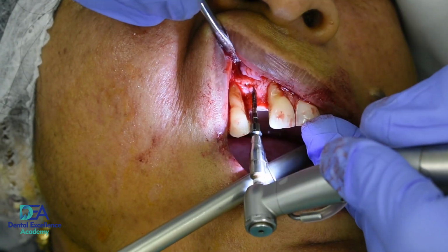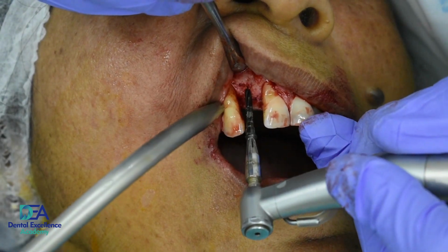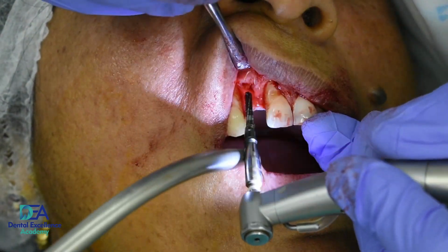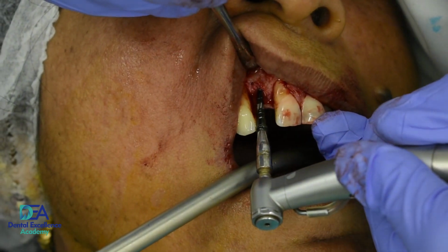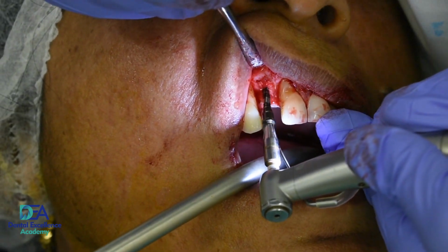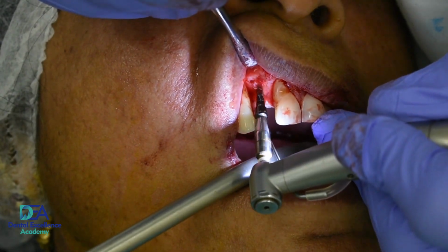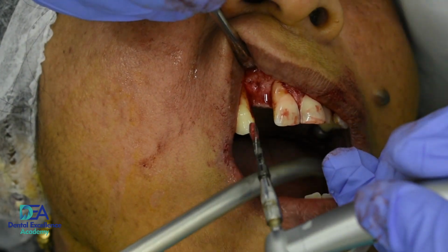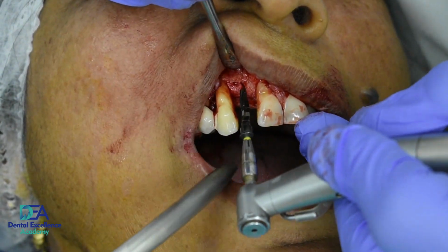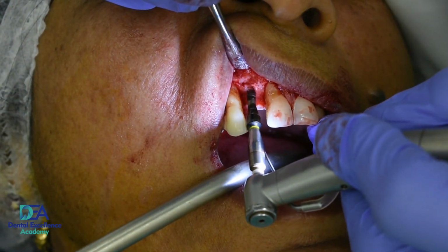It is very difficult to go in this direction because we have a minimum amount of bone. So you have to be very cautious so that you do not perforate on the buccal aspect. Timely you have to check whether you are within the confines of the bone.